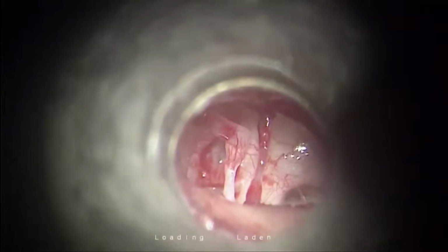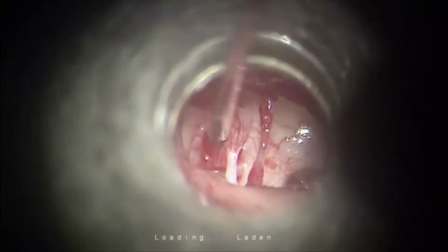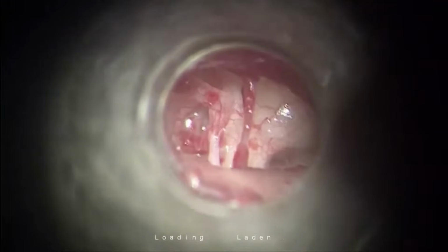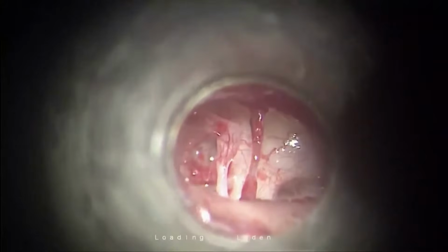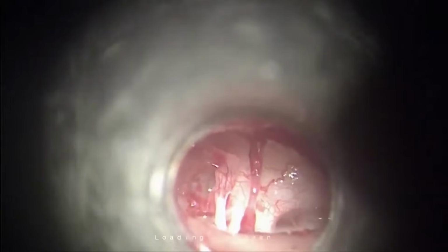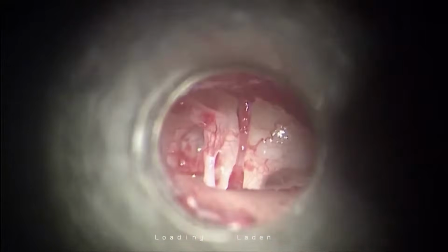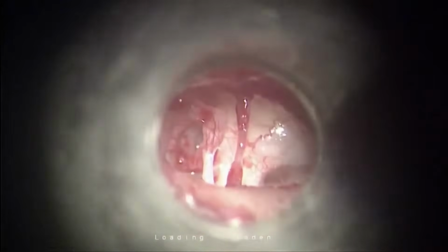Okay, so this is the next case. We have already opened. This is a conductive hearing loss, again otosclerosis. We can see this is a straightforward situation. I told you we are going to show 3 different techniques today. The next case is going to be done, Ashish is already through the preparations. That is going to be again an otosclerosis, and then we'll move on to the microtia and chronic ear.